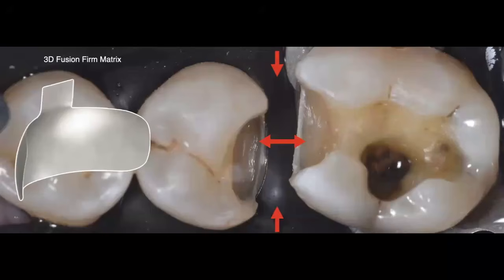Now, why am I saying this? Why am I making you aware of this? Because if you think about it, if the band is stiffer, I'm going to need to create a little bit more pressure with my wedge and with my ring in order to create a little bit of orthodontic separation between these two teeth, and then not only be able to recreate my proximal surfaces, but most importantly, recreate a tight interproximal contact so that I don't have any food packing and then secondary decay as an issue that may show up sooner rather than later because of a soft or slightly open interproximal contact. So keep that in mind.